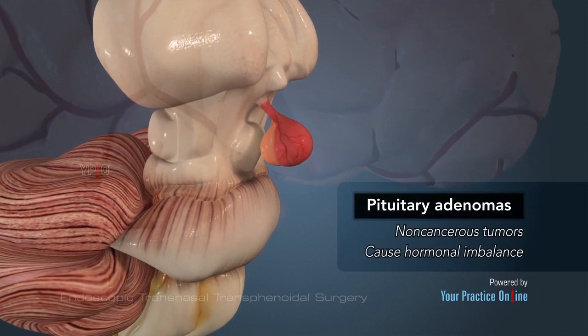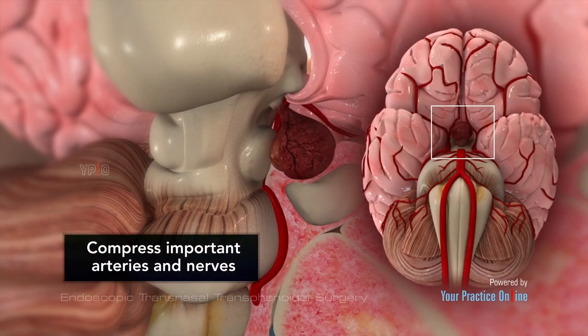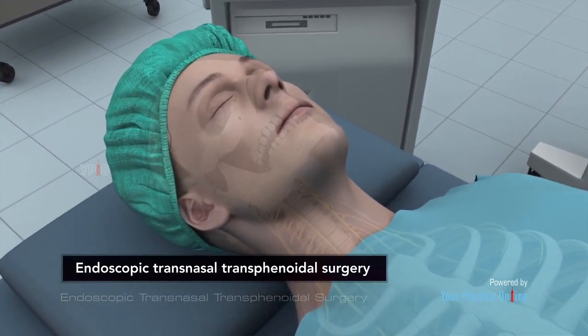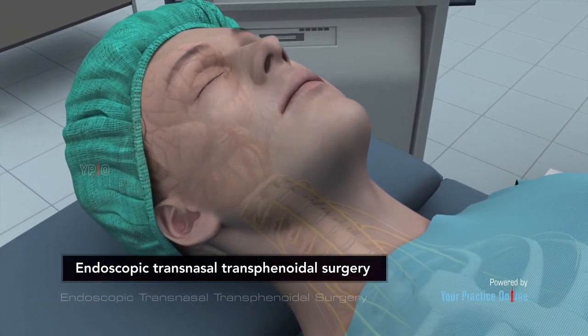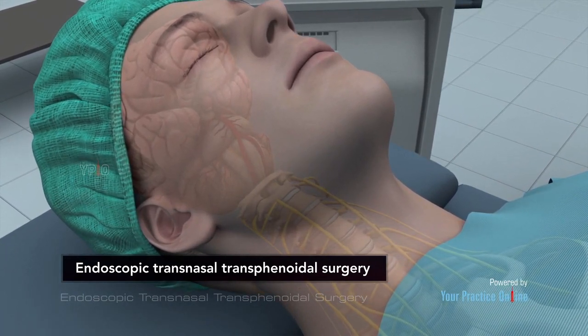These tumors cause hormonal imbalance in the body by either secreting excessive levels of a particular hormone or more than one type of hormone. They can also grow in size and compress important arteries and nerves at the base of the skull. Endoscopic transnasal transsphenoidal surgery is a minimally invasive procedure where the pituitary tumor is removed by working through the nose. This surgical technique can also be used to remove tumors located in other regions of the skull base.